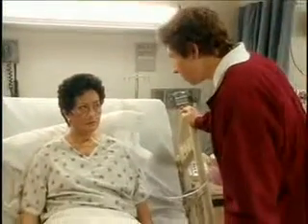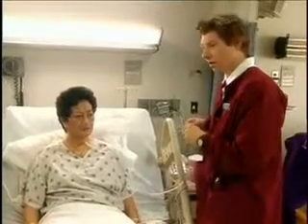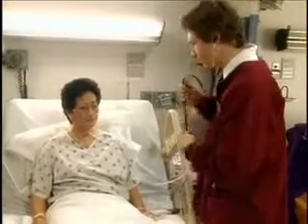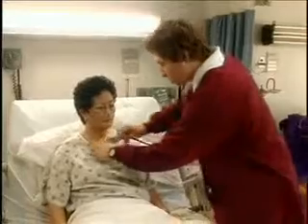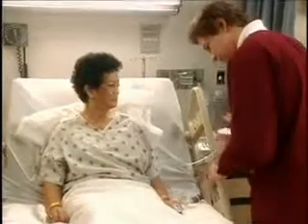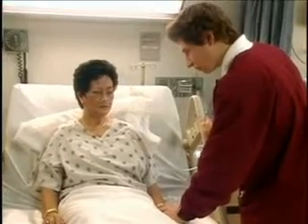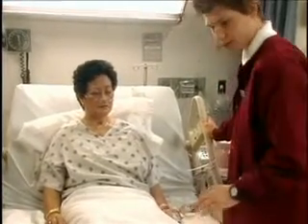Okay, Melissa, what should you do? Well, I'd evaluate all current data to determine if the patient is in distress. But she didn't appear to be short of breath or in distress. No. Okay, then check all the connections to the pulse oximeter and make sure the patient held the sensor still. What else? Maybe try a different site for the oximeter. Good. But what did you do, Mark?